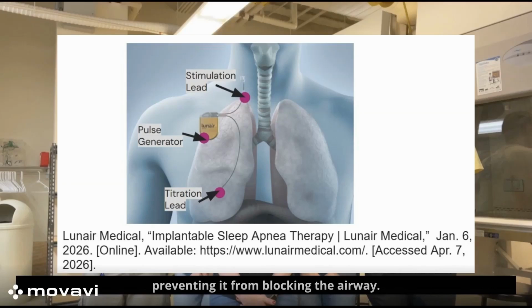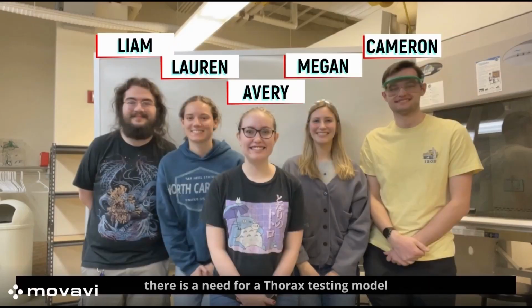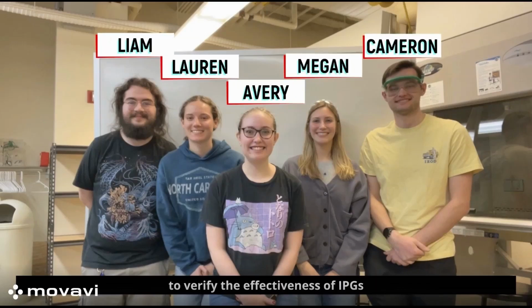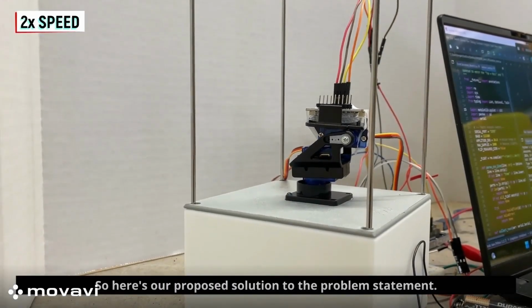from blocking the airway. As patient testing can be time-consuming and expensive, there is a need for a Thorax testing model to verify the effectiveness of IPGs throughout the design process. Our goal is to provide an electromechanical test model that can replicate the motion of the chest seen during respiration for IPG testing. So here's our proposed solution to the problem statement.